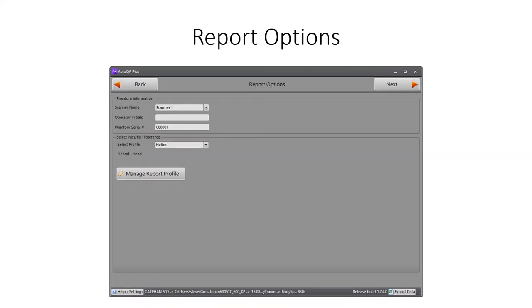This report option screen provides input fields where users can add additional information to the report header, such as scanner name, room location, operator's name, and phantom serial number. In the second section of the screen, the user selects the report profile to be used for the current selected set of CatPhan images. Here also, the user can edit and create new report profiles.